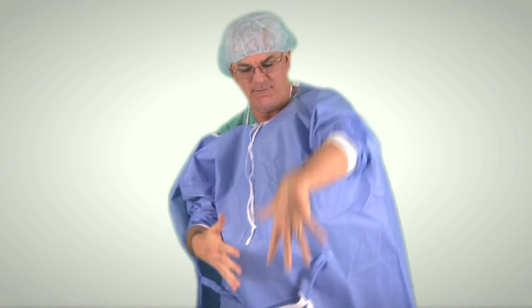As a review and going back to the very beginning of this video, we tended to not learn how to glove ourselves. We tended to come in the room, get the gown put on for us, have the gloves held out for us. And really it's the surgical techs and the OR nurses who are really better at gloving than we are. But we should take a page from their book and learn how they do it. I've demonstrated here all the little steps to make sure that you are able to glove up correctly and smoothly.